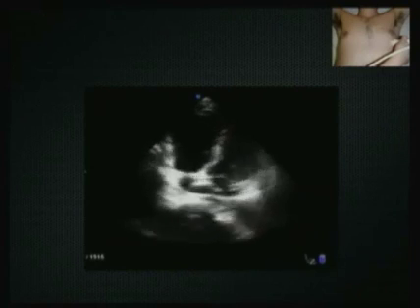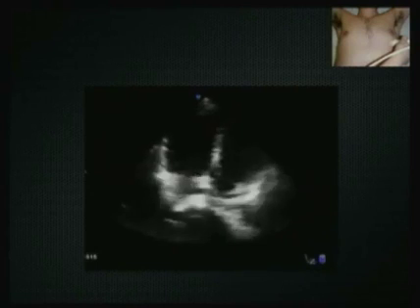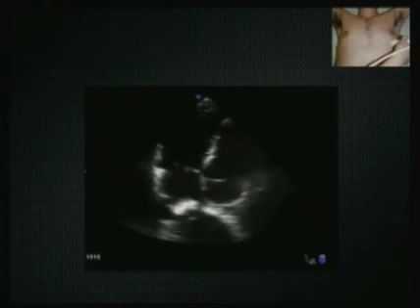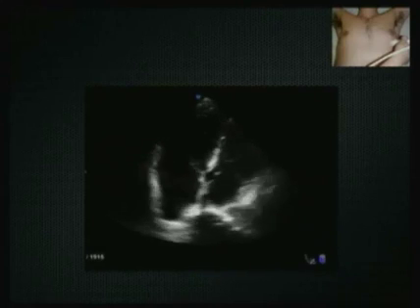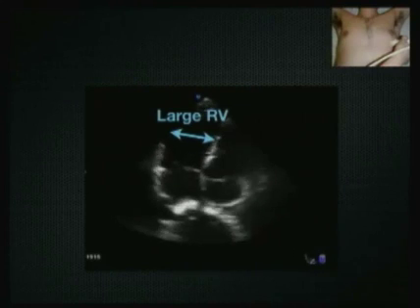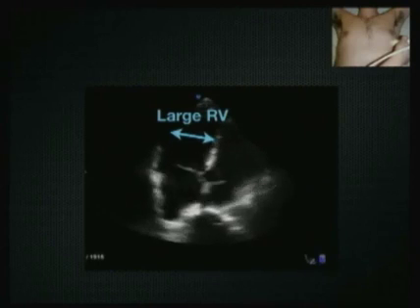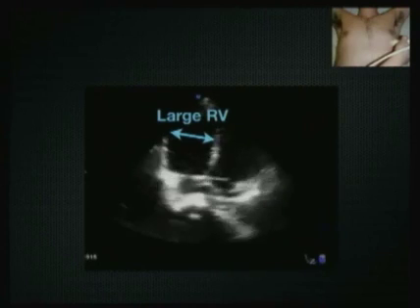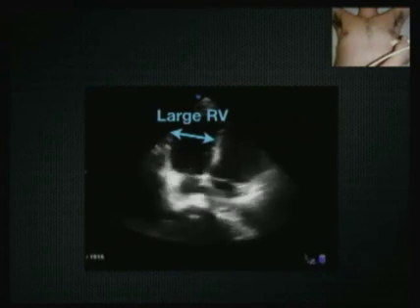And we take a look at this patient's heart, and when we look at this immediately, we often might think, oh, we've got the probe flipped the wrong way, because the LV, the left ventricle, appears to be on the left side of the screen, where the right ventricle should be. But in fact, this is actually just a very enlarged RV. And we talk about normal ratios of RV to LV. Typically, people say 0.6 is the ratio size that is normal. Whenever you get up to 1, then you've got a significantly enlarged RV.